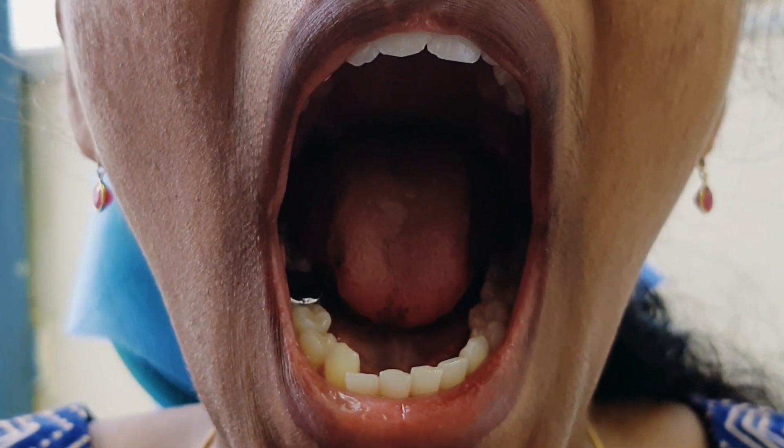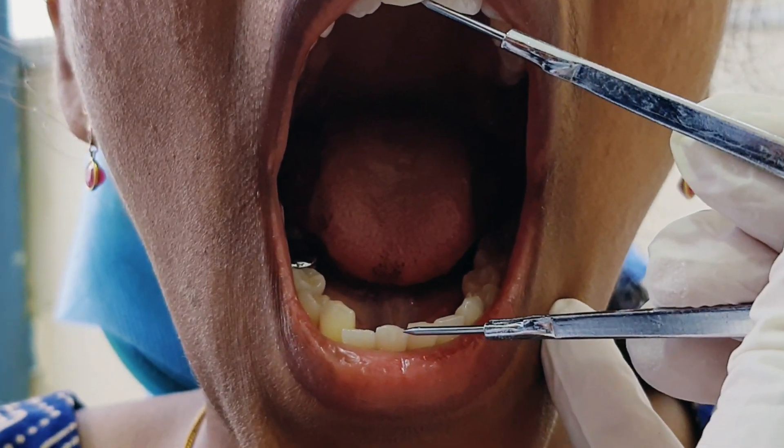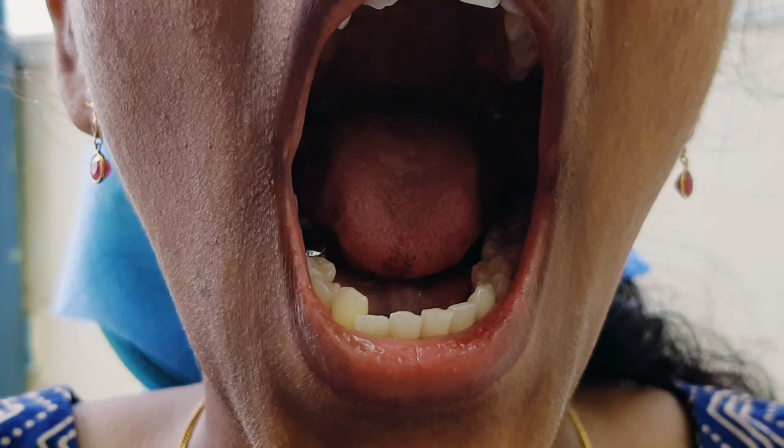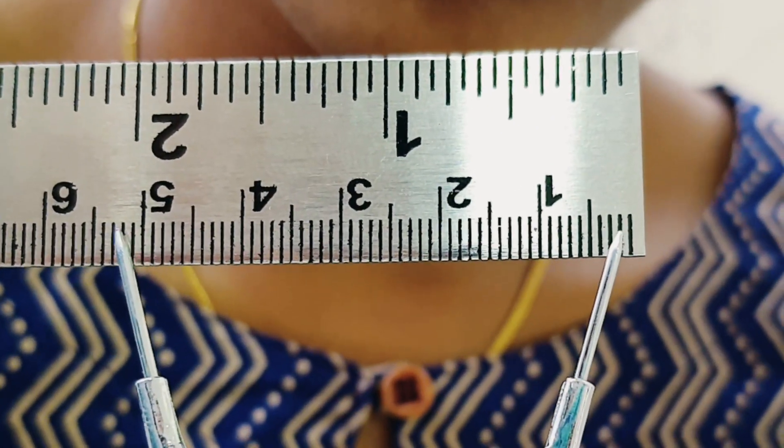Measuring maximum mouth opening by using a divider and scale. First, ask the patient to open the mouth wide. Then, place the divider at the incisal edges, and measure it with the scale. In this patient, the maximum mouth opening is 51 mm.